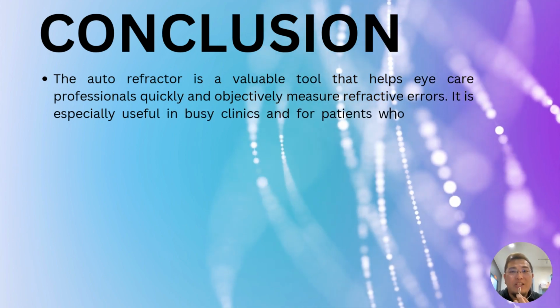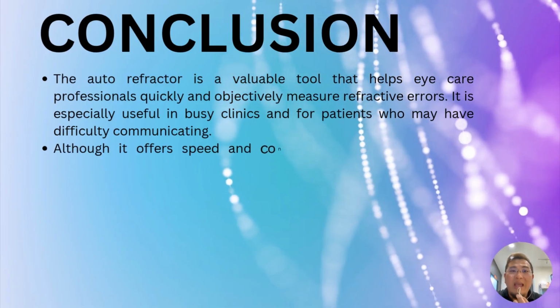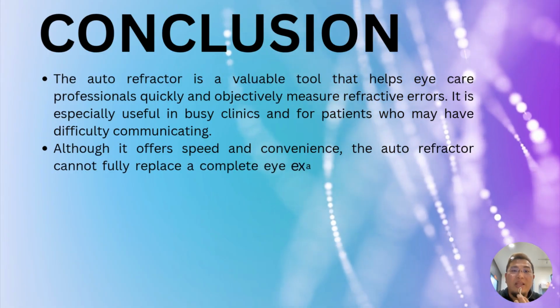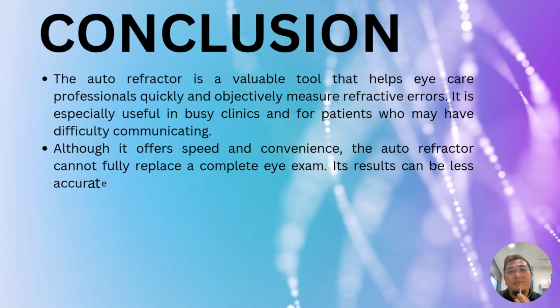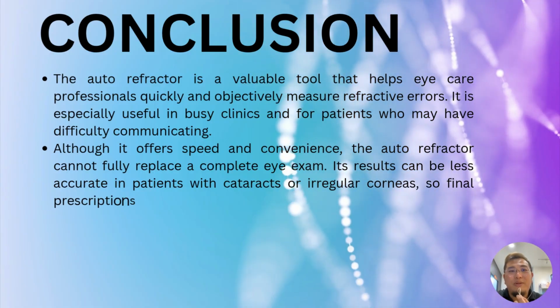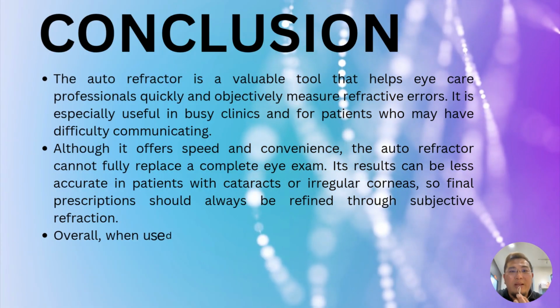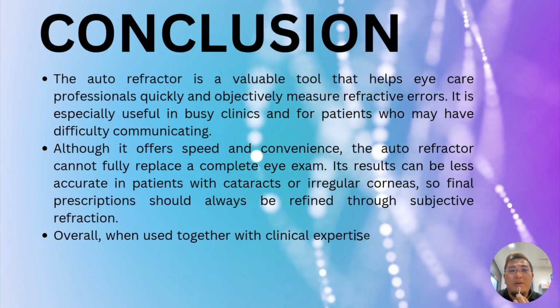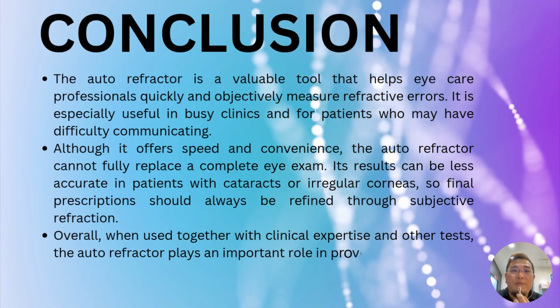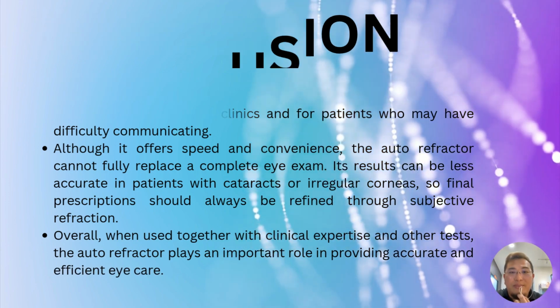It plays an especially important role in a busy clinical setting and with patients who may have difficulty communicating, such as young children or elderly individuals. However, while it provides speed and convenience, it cannot fully replace a comprehensive eye exam. Its readings may be less accurate in patients with cataracts, corneal irregularities, or accommodation issues, which is why subjective refraction remains essential to validate any prescription.